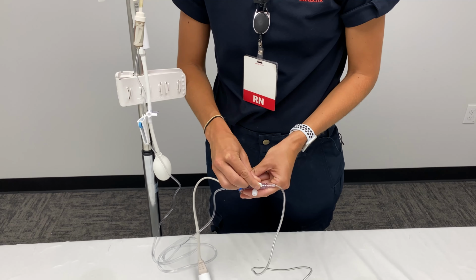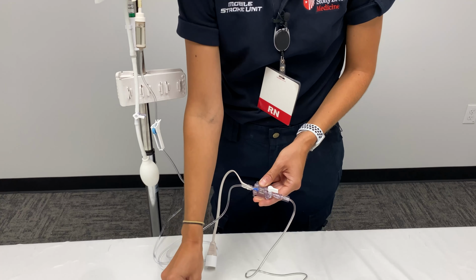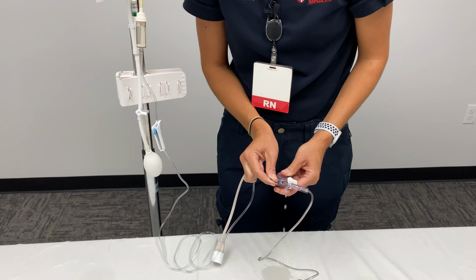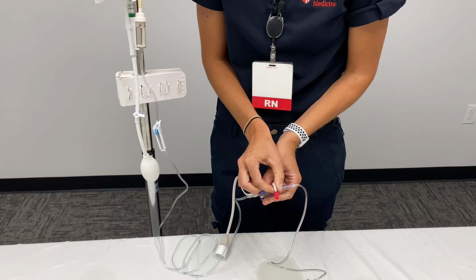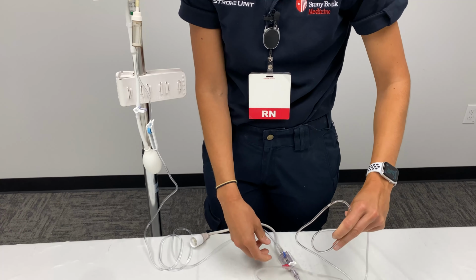You turn the dial off in the direction opposite your bag. Take this cap off. Flush your line until you see that all the air is out. Cap it and turn your dial towards the cap. Then you're going to move to your next line, or your next port.